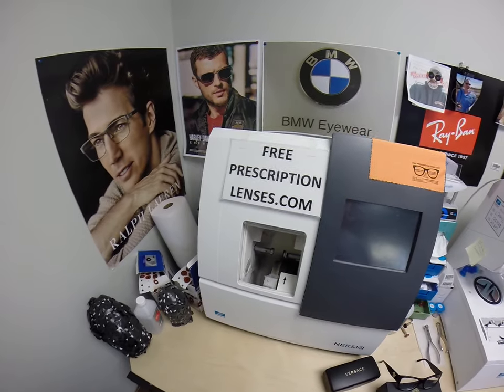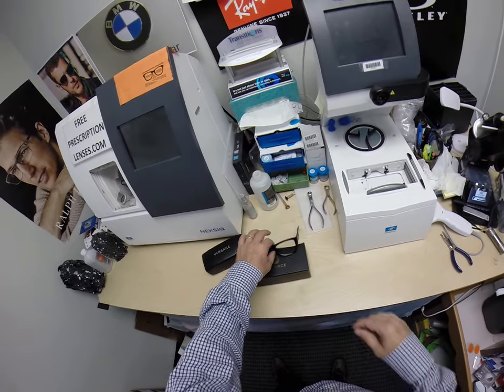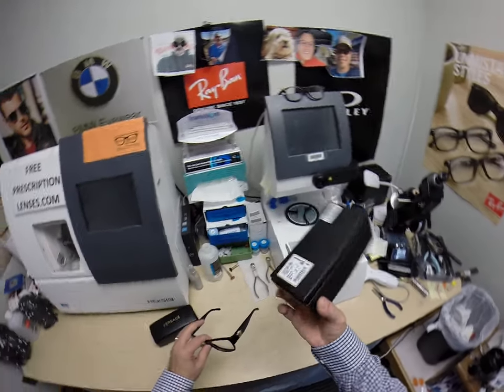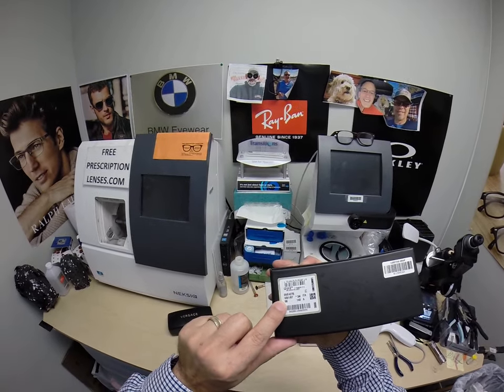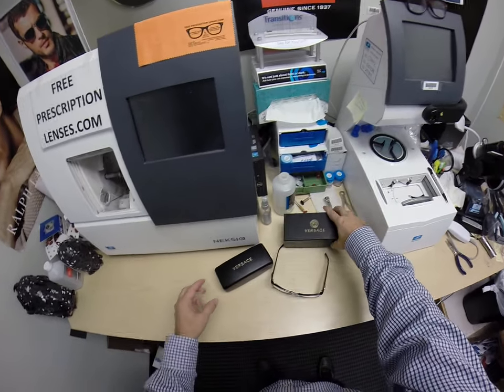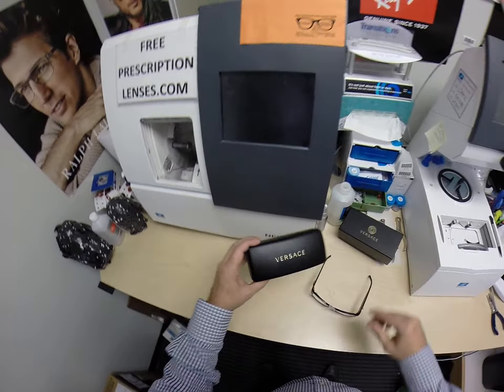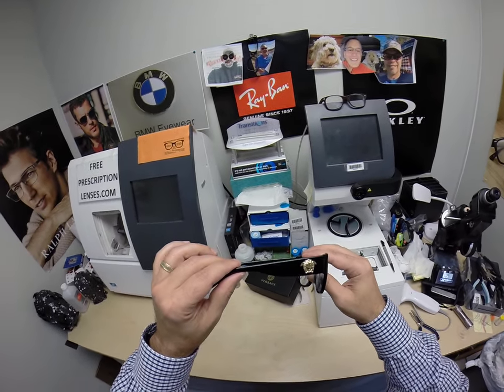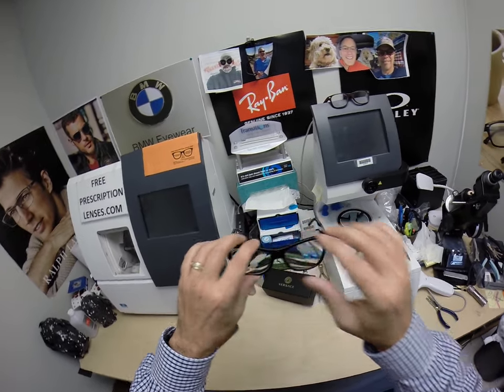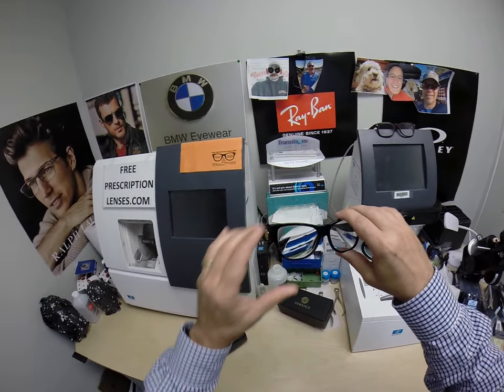Hello everyone, Seymour Better here with FreePrescriptionLenses.com, and I want to show you a cool frame. This is the Versace 4275, color GB1, in the 58 eye size. You get all the packaging from Versace with that. It comes with the Versace hard shell case, and this is the 4275 — it has the largest Medusa that Versace makes on both sides of the temple.